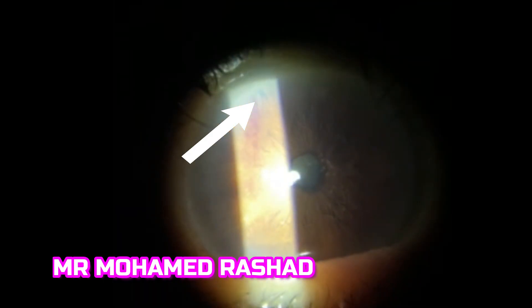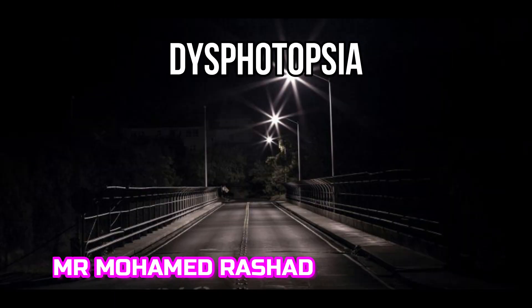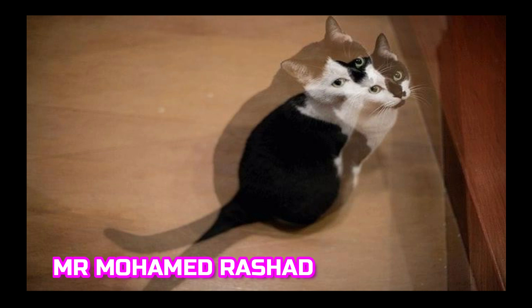Bleeding is very common — don't panic. Just press with the lens and choose another side. In this case we have two spots of bleeding and this is the opening. The patient has to stop any blood-thinning medication for two weeks before the procedure, and make sure blood pressure is controlled. Photopsia and double vision can occur and are avoided by not placing the opening under the marginal tear strip.